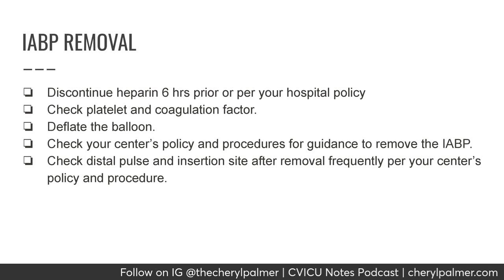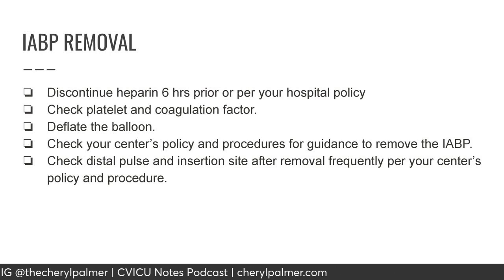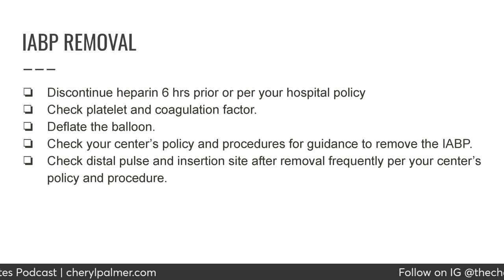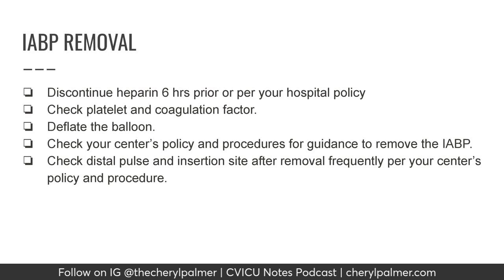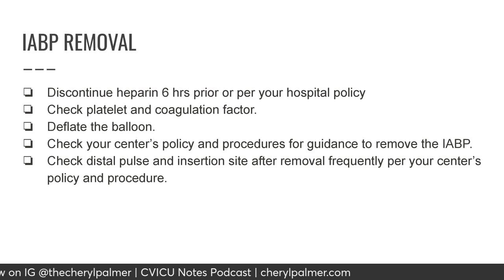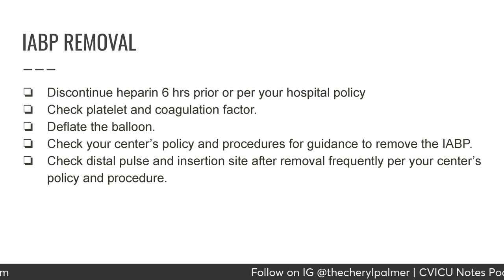So once, nurses do not remove balloon pumps. It's usually a physician that does that or a specially trained technician. So what we have to do as nurses is just to observe after removal for any bleeding or changes in their hemodynamics.